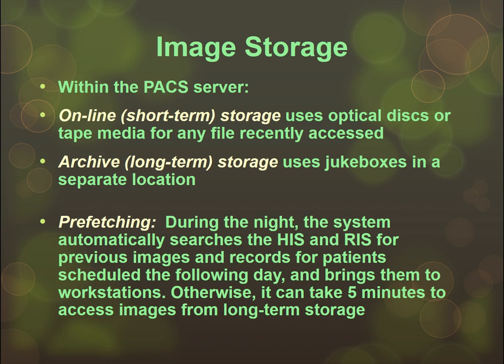So you're going to put them in a different part of the data center or a different part of the building. Once studies sit around in online storage for a while, they're not being used, because once the image gets viewed, read, dictated, it's not going to be used until it's time to be used as a comparison. So it will sit there for a couple of days, maybe even a month, and then it will get archived off to the jukeboxes in the separate location.